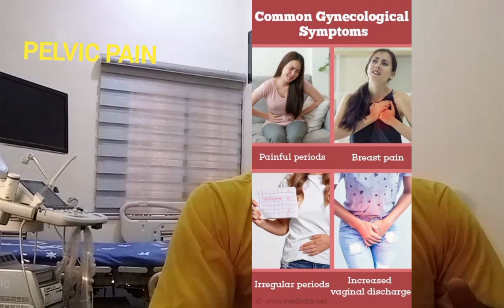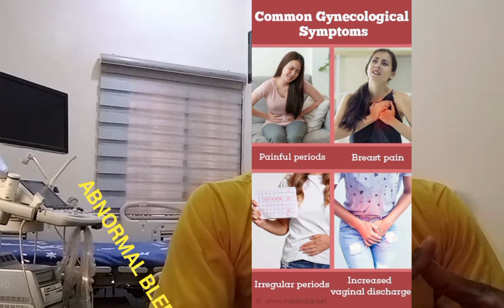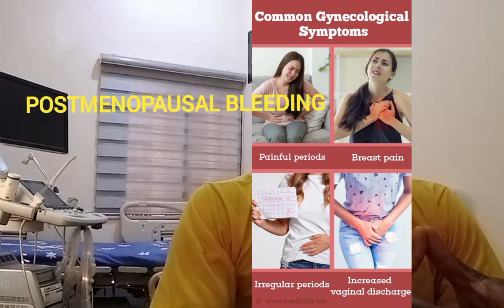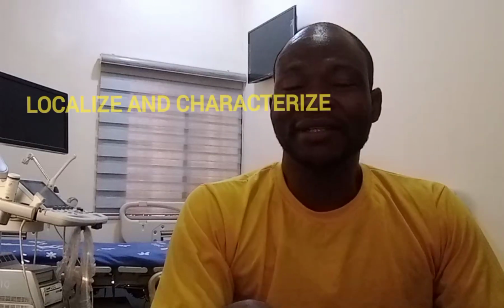Gynecologic complaints will include pelvic pain, dysmenorrhea, menorrhagia, metrorrhagia, amenorrhea, abnormal bleeding, post-menopausal bleeding, etc. You can also do pelvic ultrasound to localize and characterize pelvic masses that were noted during physical examinations.